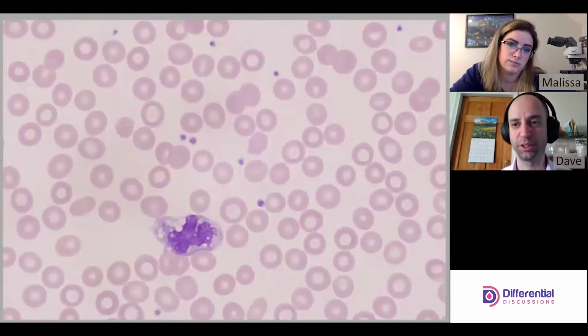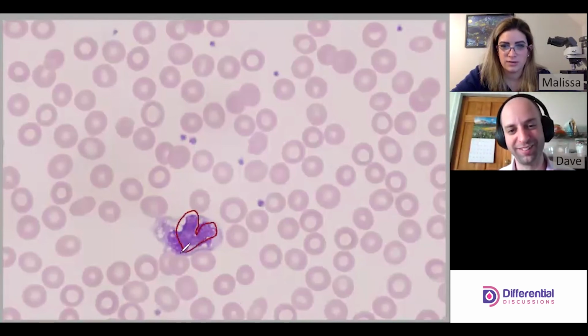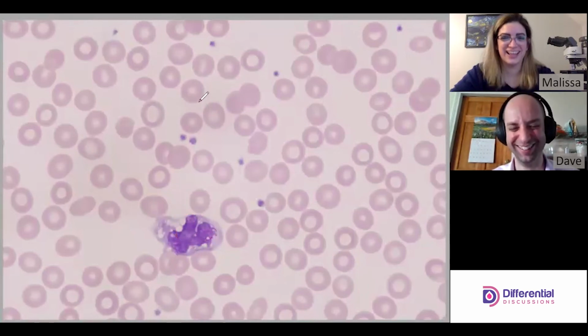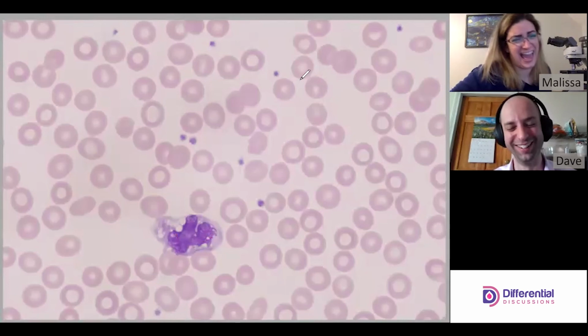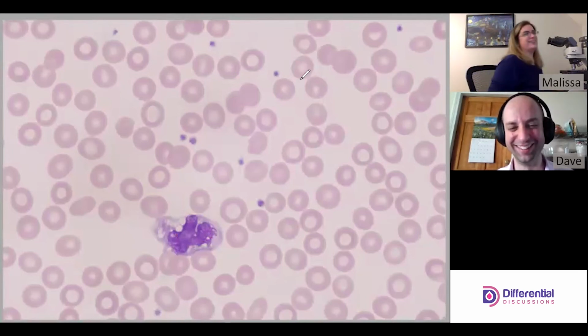And then our shape, we see the textbooks also like to use pleomorphism, right? It's owing itself to the different shapes and conformations the nucleus can take. And we have the horseshoe. Almost like a heart. It's a very mono heart. Very abnormal, irregular. Looks like I drew the heart. Me and my terrible drawing.